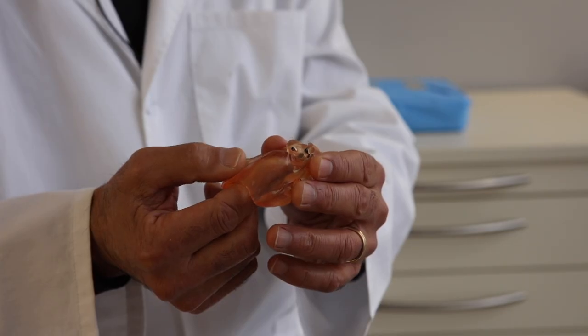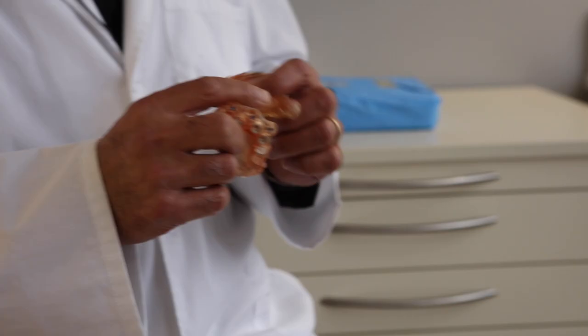If an implant appears to be off — usually it's the most posterior one — and other adjacent implants do appear to be where they need to be, complete those osteotomies first using your surgical guide. Then come back and complete the final osteotomy for the one you're not happy with, centering it on the bone freehand but using those completed adjacent osteotomies as a reference point.